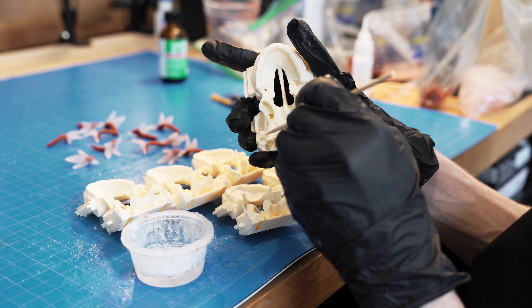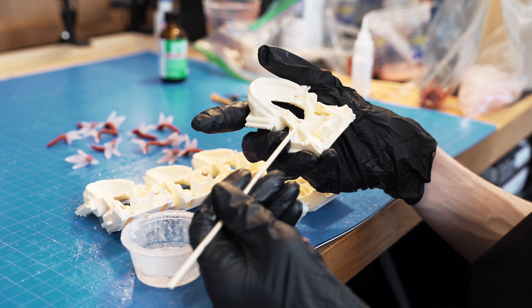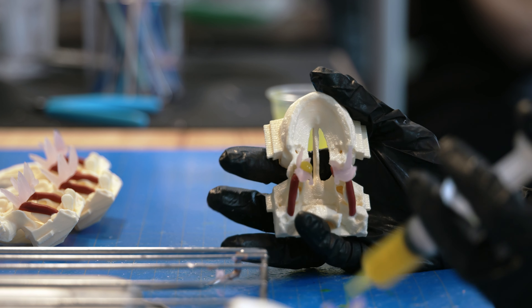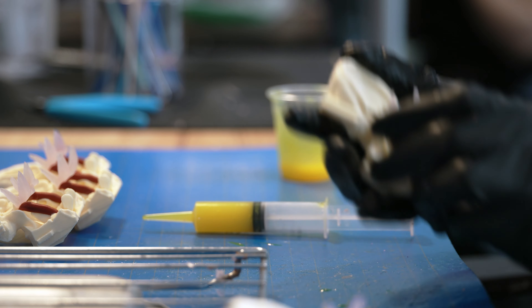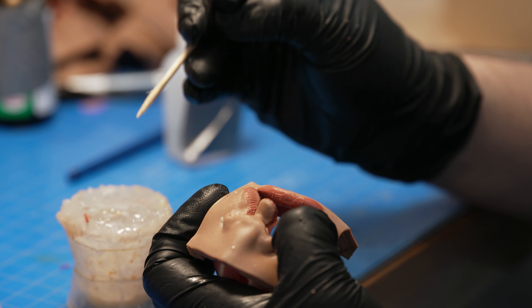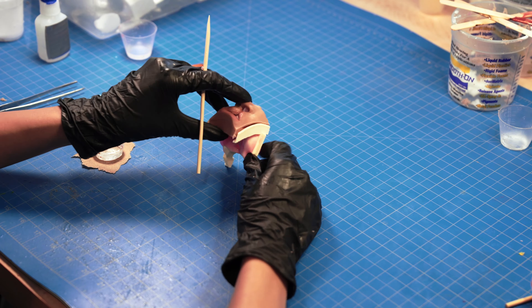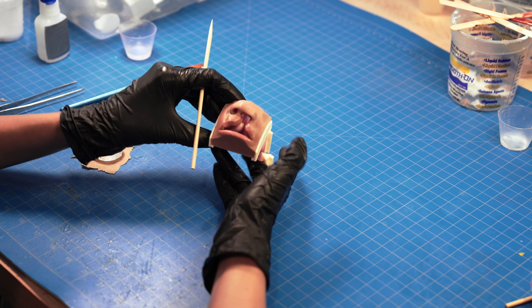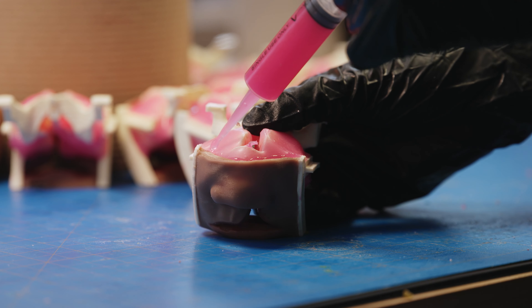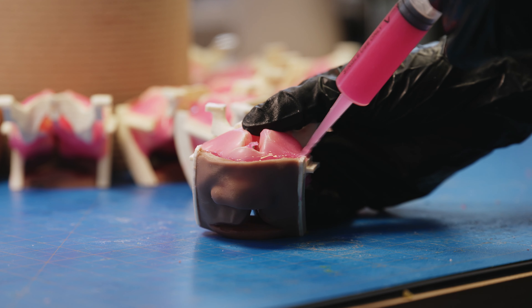Assembly involves attaching each molded component to the 3D printed bony material. After completing assembly, using trade secrets, this simulator is coated with a silicone to both conceal the underlying tissue and resemble soft tissue membrane.